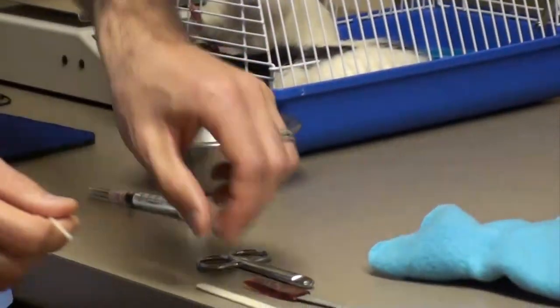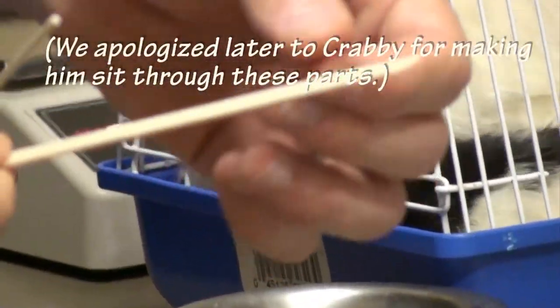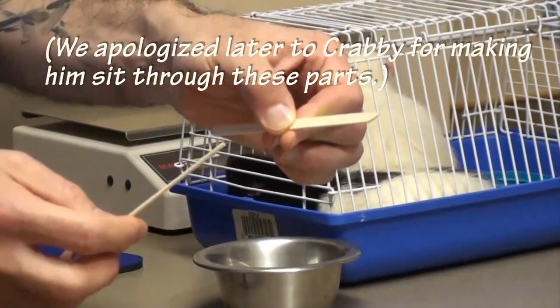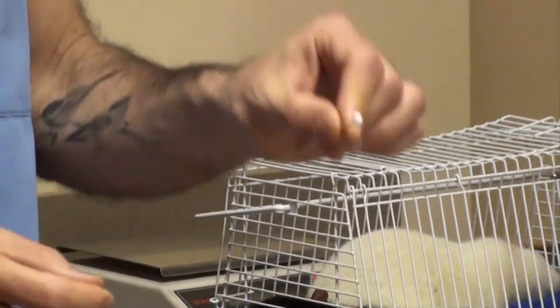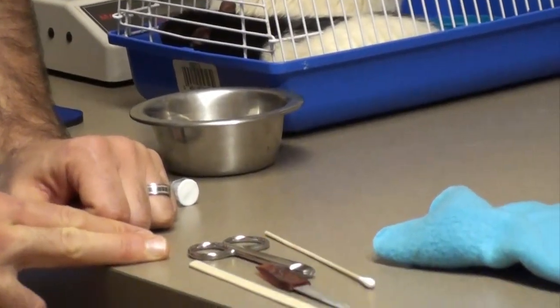If you don't have a tongue depressor, you can pick them up at discount stores or craft stores — popsicle sticks or any of those work really well to slide behind the teeth. Otherwise, you can use a Q-tip or a cotton-tipped applicator to place behind the teeth to push the tongue back and hold any other tissues out of the way, which is the most ideal way to do it.